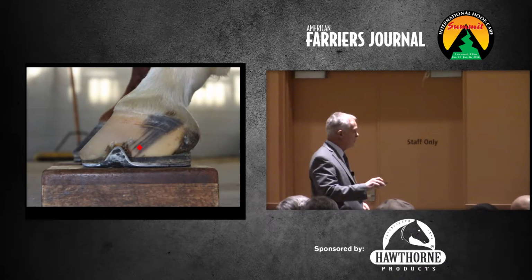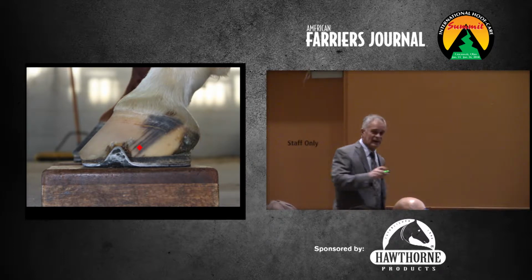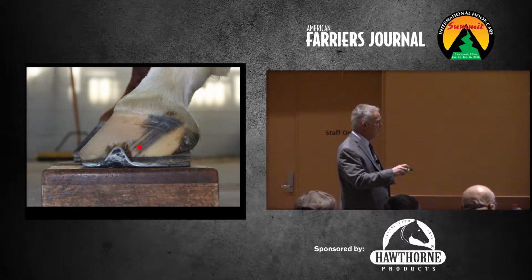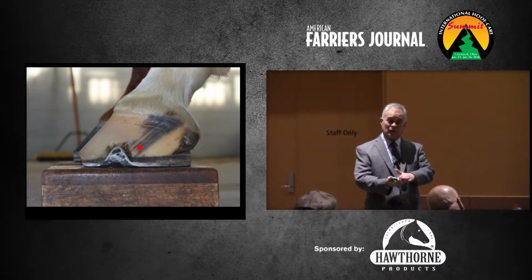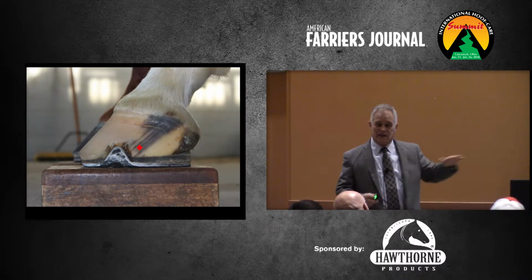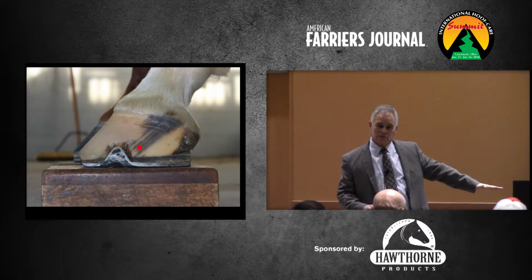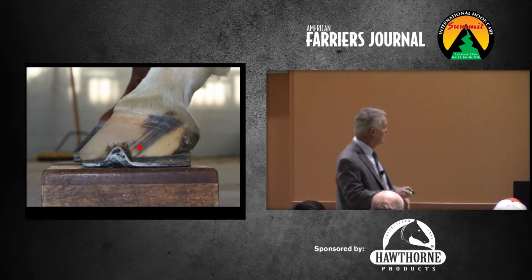So this is the lateral view from the side. And again, this is where you may have to help the vets. So this is centered about 1/2 to 3/4 of an inch above the hoof wall, where I'm thinking the bottom of the coffin bone would be. If it was a Saddlebred and had a lot of foot under it, I'm going to have to go higher and guess where the bone is. Again, it's from the bottom of the hoof wall, not the bottom of the shoe. Okay, so you're trying to guess where that coffin bone is.